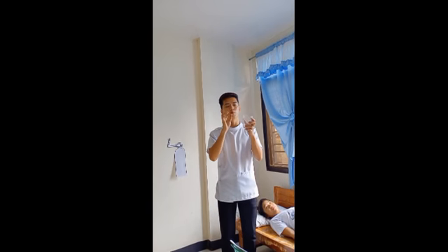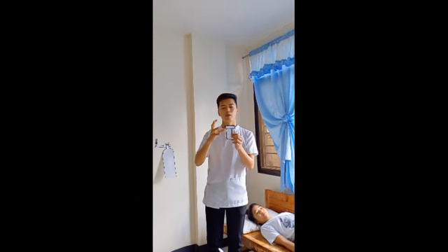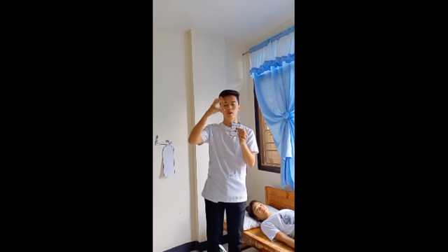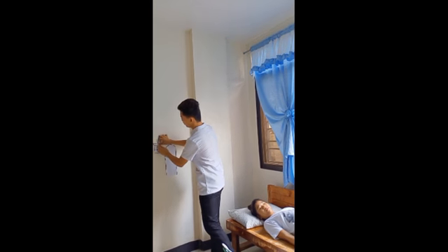So you need to put some distilled water in the humidifier. This is the humidifier cup, and let us show that I put some distilled water if needed. Let's put the humidifier bottle on the oxygen tank, just like this. And also attach the prescribed oxygen tubing and the description of the humidifier.